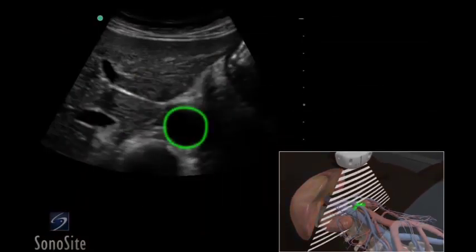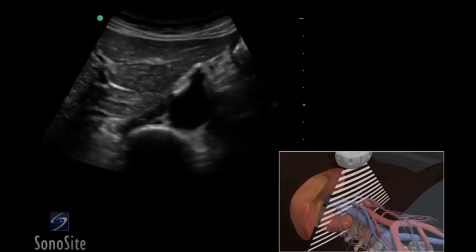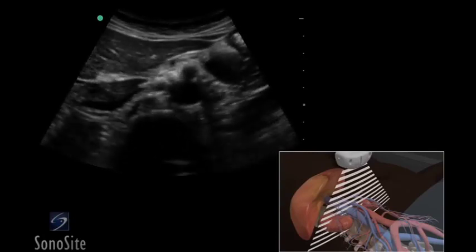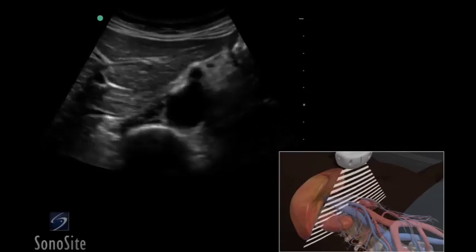The aorta is seen as a round, pulsatile structure anterior to the bright reflection of the vertebra. The vena cava is an oval structure immediately to the left of the aorta on the screen, which changes in caliber with compression or deep inspiration. The abdominal aorta will course gradually, becoming more superficial as it progresses distally.